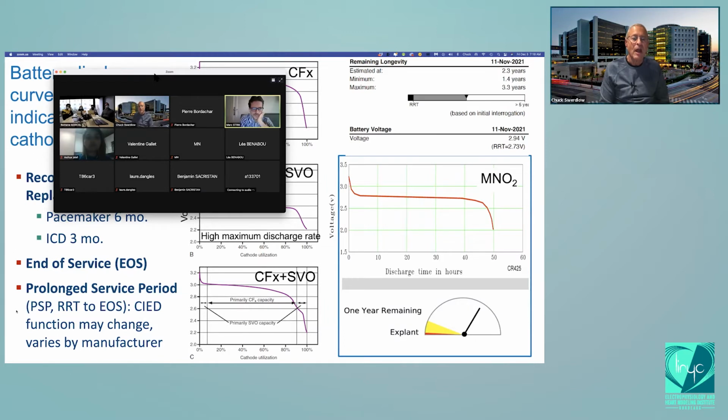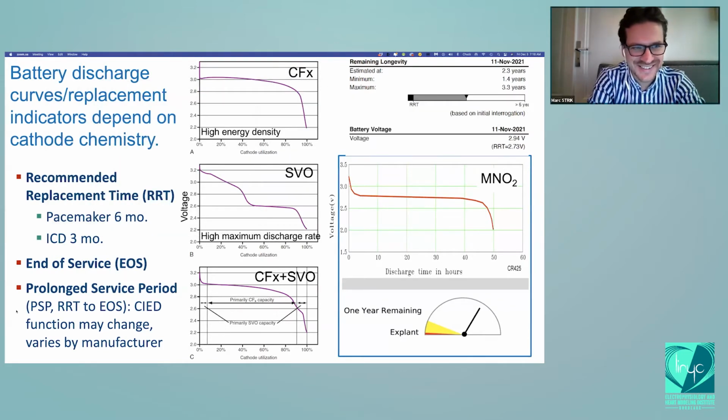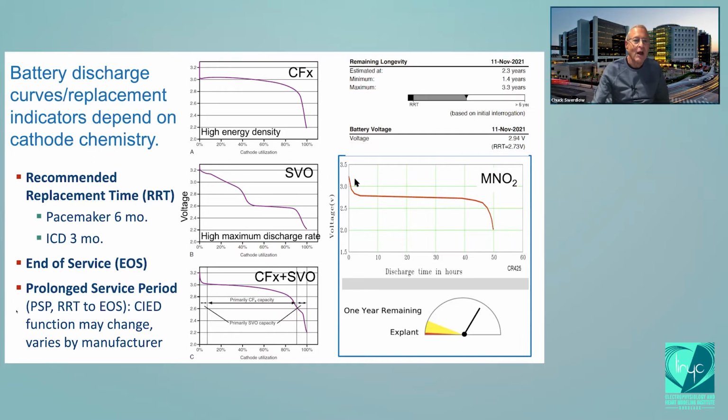And internal resistance is notoriously variable, right? The rate at which it increases over time is very hard to predict and has wide error bars, and that's the problem with that indicator. Now you've exhausted almost everything I know about this subject. Okay. That's perfect, thank you. I told you battery chemistry was not my strongest field, and for sure it's not.